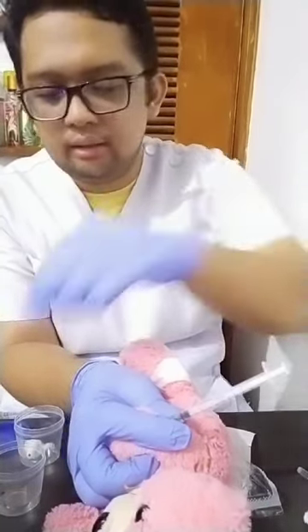You don't have to aspirate. And then continue injecting. Then put dry cotton balls and apply a slight pressure, and then apply plaster.